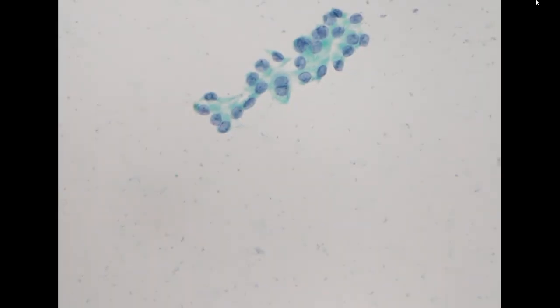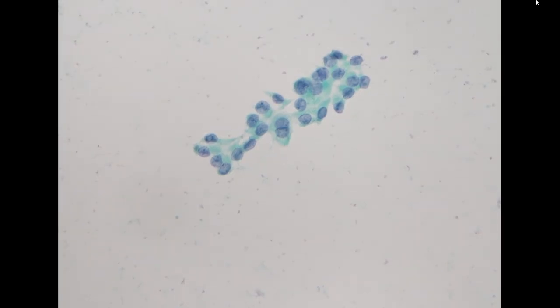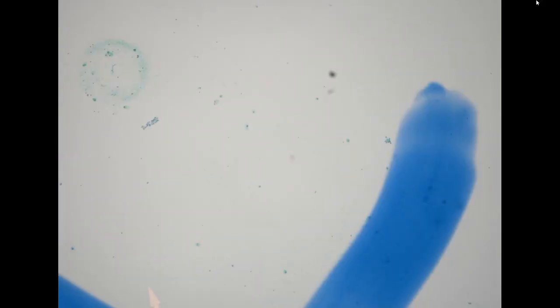In this second cluster, we also see pale chromatin, oval-shaped nuclei, irregular membranes, and here we see there's a pseudoinclusion over here. So even though we only have 2 cellular fragments, it is still diagnostic for papillary thyroid carcinoma. So we will call this case upfront as TBS6, PTC.